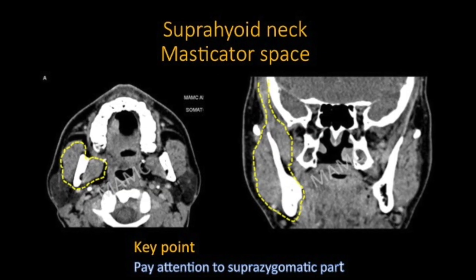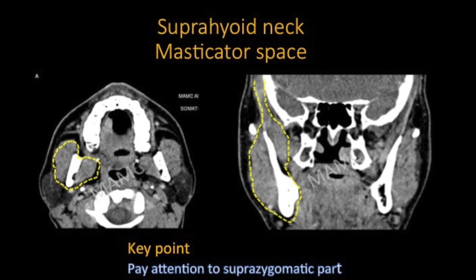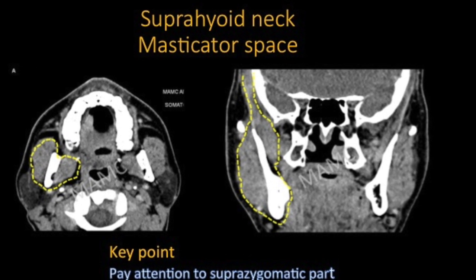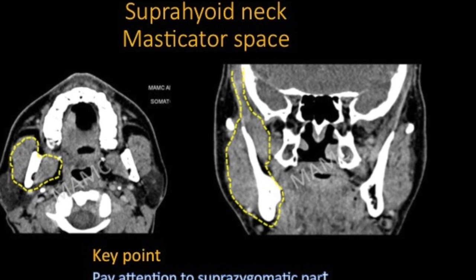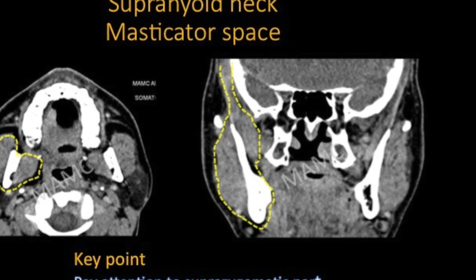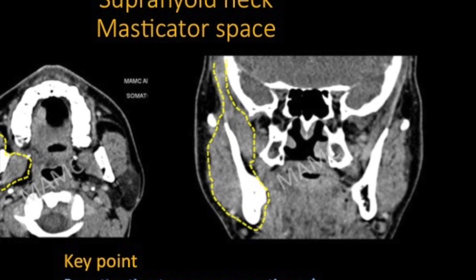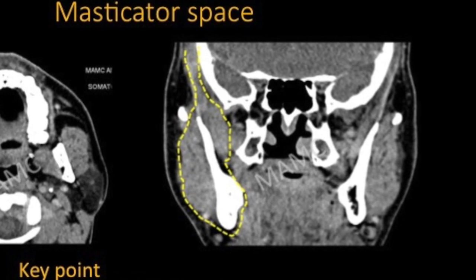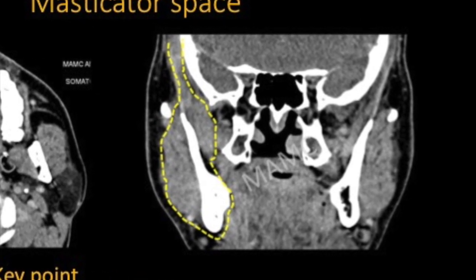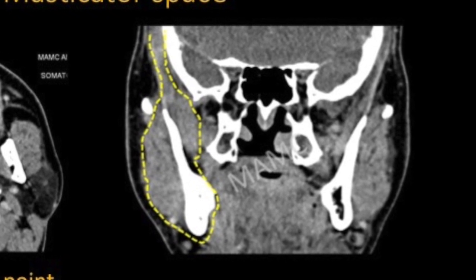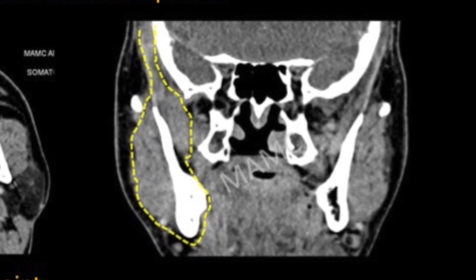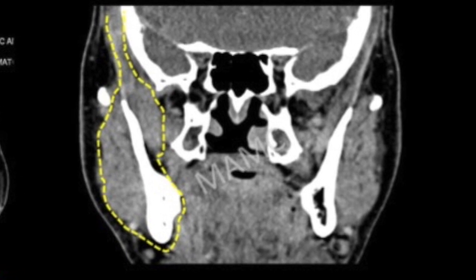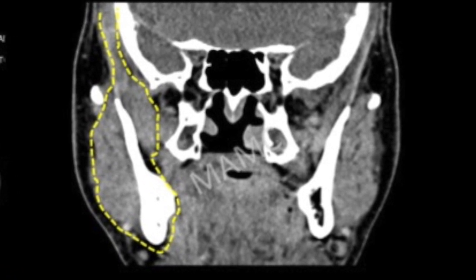This is how we see it on the coronal scan — the mandible along with the muscles of mastication. What we need to pay attention to is the suprazygomatic part where the temporalis muscle is arising from the scalp. All pathologies of the masticator space can extend superiorly to involve this portion, so remember to pay attention to this part as well.